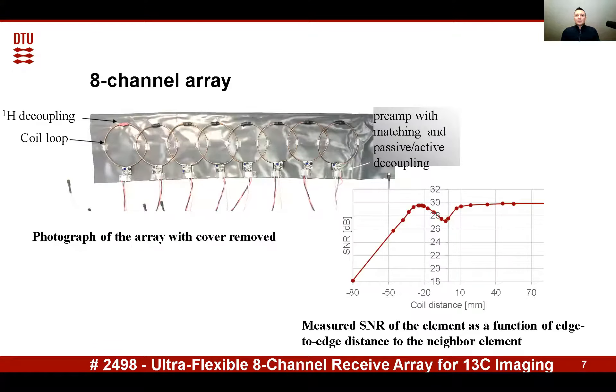The coil is used as an element in an 8-channel array. The photograph of the array with the cover removed is shown here. The pre-amp circuit size is a small fraction of the array, which supports the array flexibility.